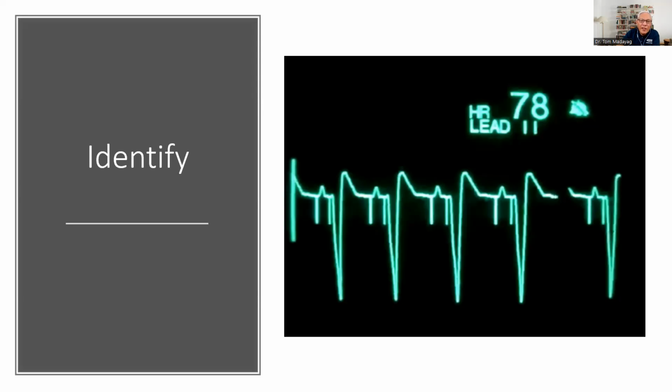All right, the correct answer here is it is an atrial and ventricular pacemaker. An atrial and ventricular pacemaker, such as what is demonstrated here, is also known as an AV sequential pacemaker. Whenever the atrial pacemaker is activated, it also will continue it into the ventricles, and that is why it's called an AV sequential pacemaker.